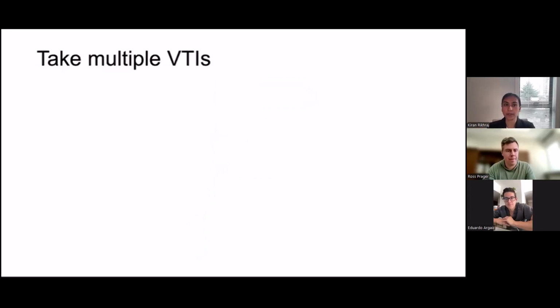I then want to talk about taking multiple VTIs. This is important because there is some beat-to-beat variation in your VTIs, particularly in patients who have arrhythmias like atrial fibrillation. The recommendation is to take, in someone in sinus rhythm, at least 3 VTIs and take the average of those VTIs to get your true number.